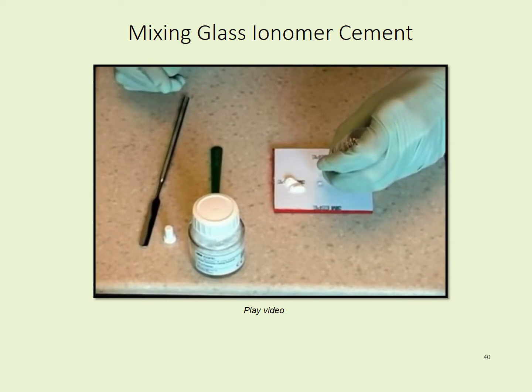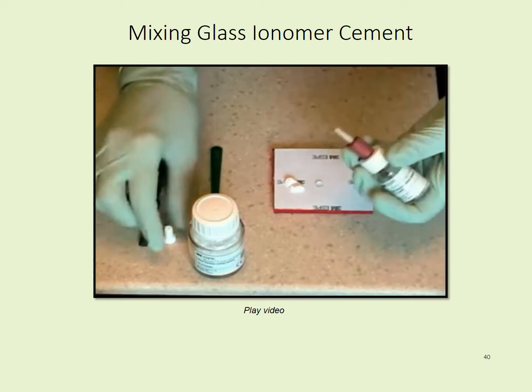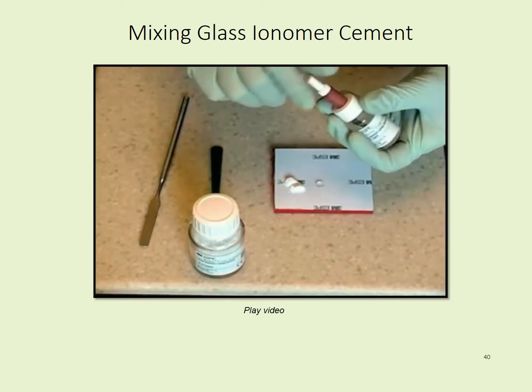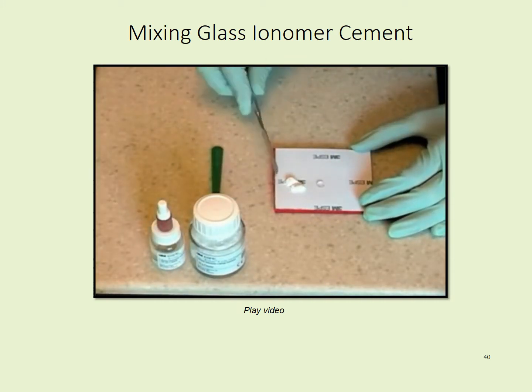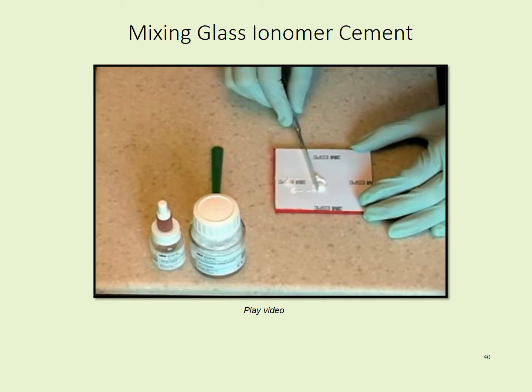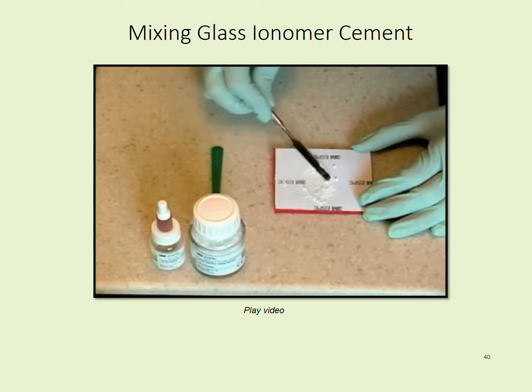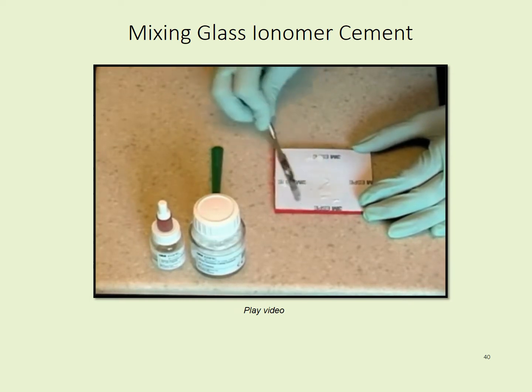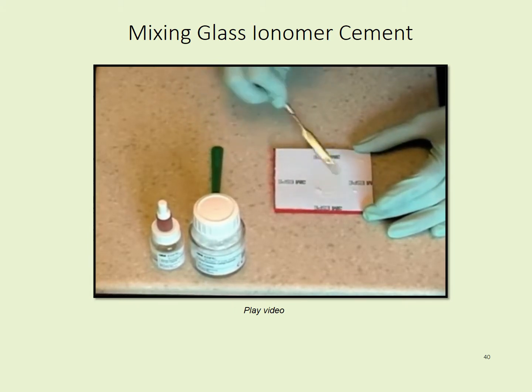Holding the dropper or liquid bottle perpendicular to the pad, dispense the recommended amount of liquid close to the powder without touching. Replace the cap on the liquid immediately to prevent evaporation. Using the cement spatula, add the powder to the liquid in one portion. Incorporate the powder into the liquid and mix well using a figure-8 motion. Complete the mixing within 60 seconds.